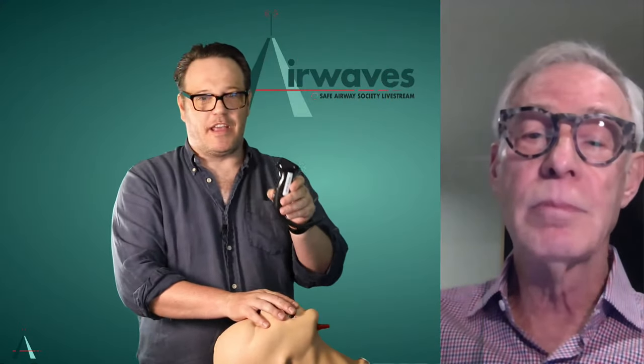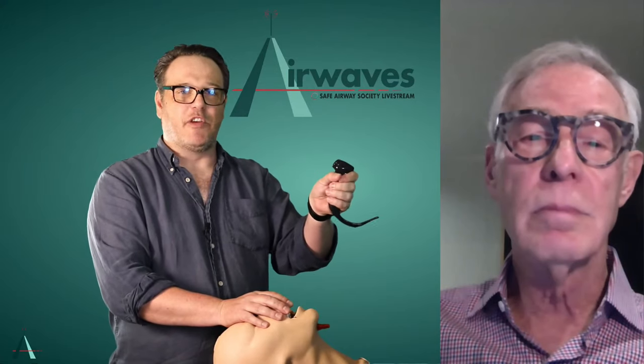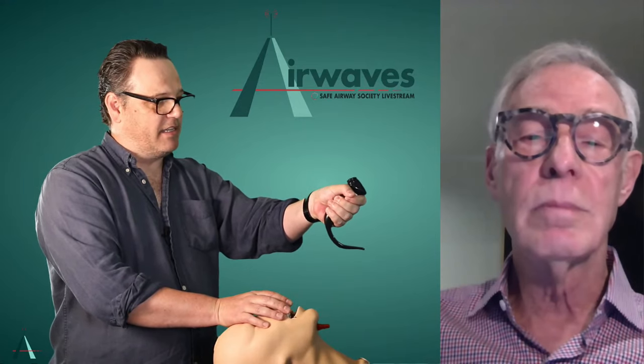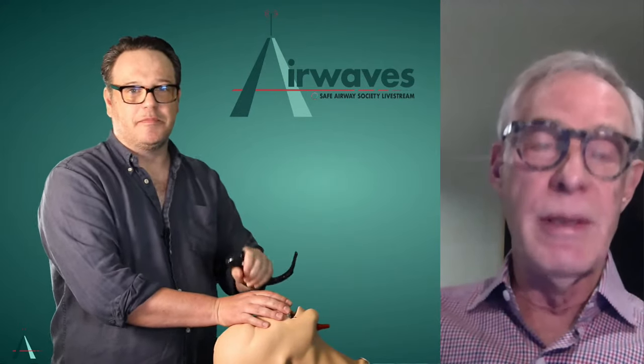So I think what that question was about, and I know I've seen George Kovacs and Adam Law talk about this, is that if you're in too far, to get back to the right position, I think they talk about rotating the blade, withdrawing the blade and lifting the blade slightly to get back to the optimal position. I completely agree, and I think we're probably saying the same thing. What that question is about, the idea of withdrawing and tilting, is really a corrective maneuver because you've put the blade in too far. What you're teaching is not to get to that point in the first place.